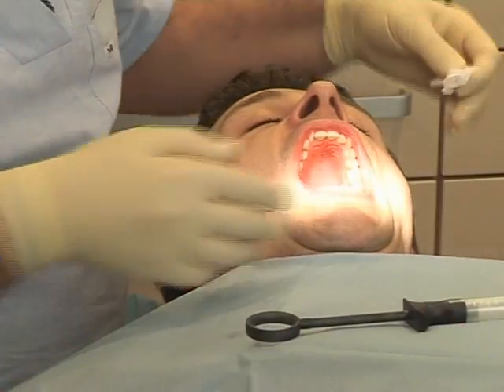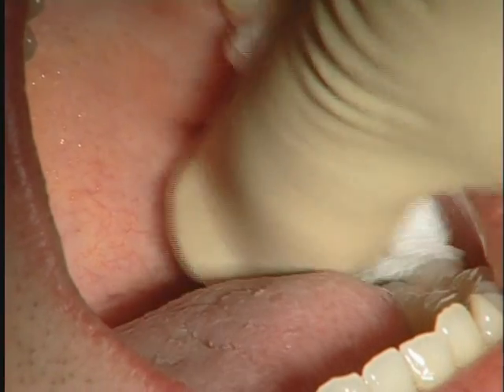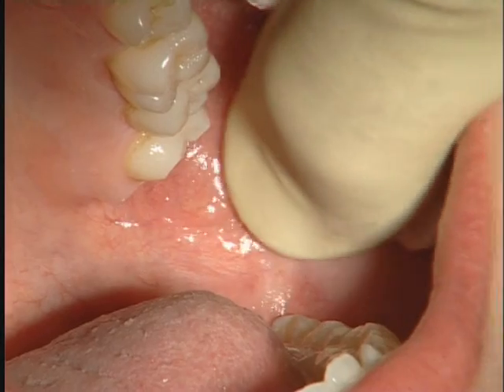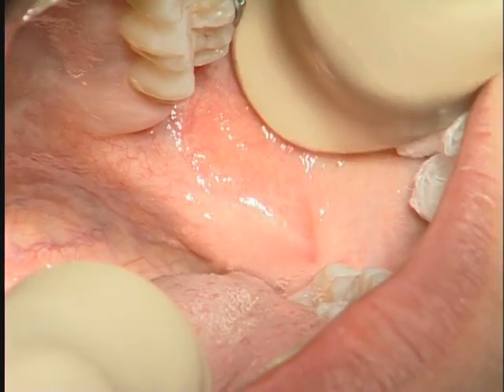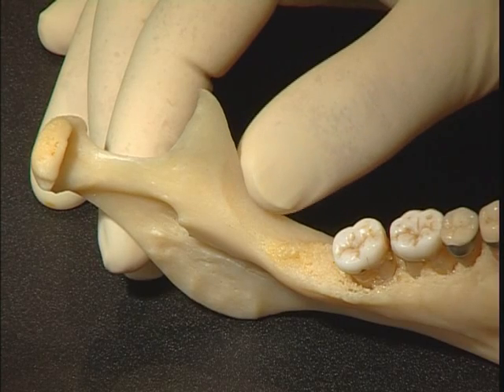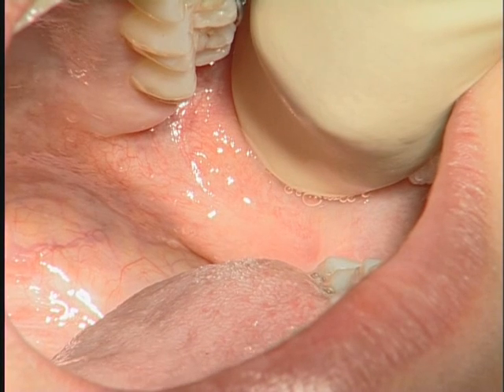The patient is asked to open his mouth wide, and then the mucous membrane is cleaned with a sterilized gauze so that the area can be clearly seen and palpated. Even though the mucous membrane landmarks vary from one patient to another, there are still anatomical markers which should be used so that you avoid any serious mistakes. However, they should be correlated with the bone landmarks, as these are by far the most reliable.